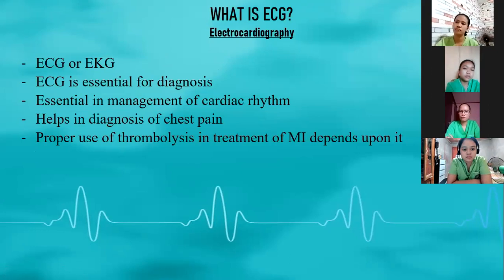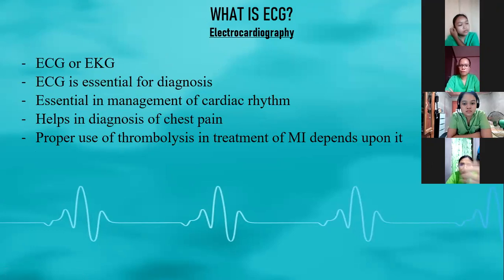Mas madedetermine, nawala kasi yung sample ng aking ECG. Kanina nung hindi ko hinahanap, ayaw magpakita, ngayon na nahanap ko na, ayan. Mamaya turo ko sa inyo. Ayan. Helps in diagnosis of chest pain. Proper use of thrombolysis in treatment of MI depends upon it.